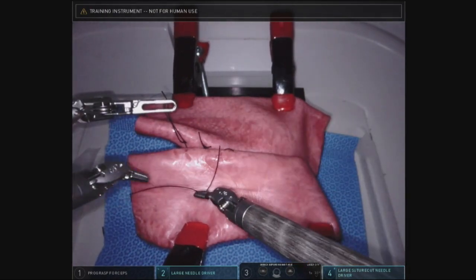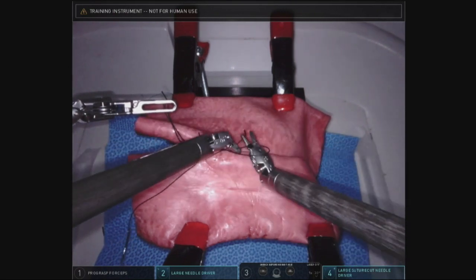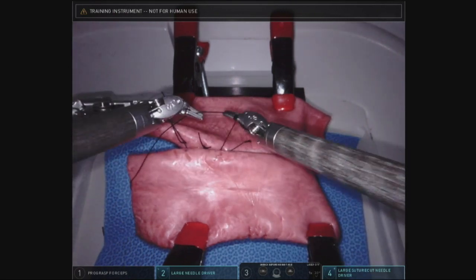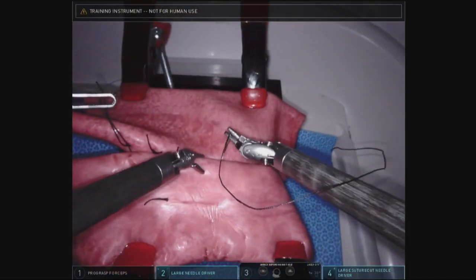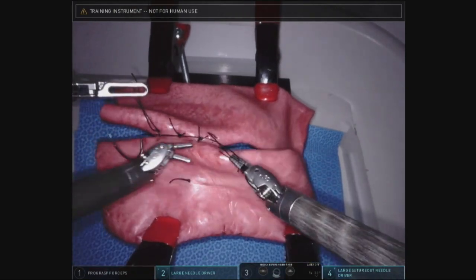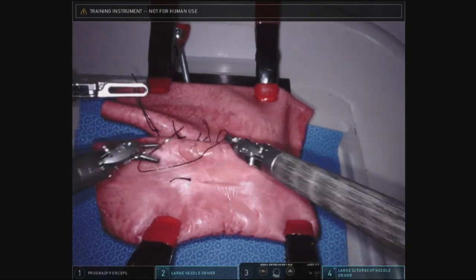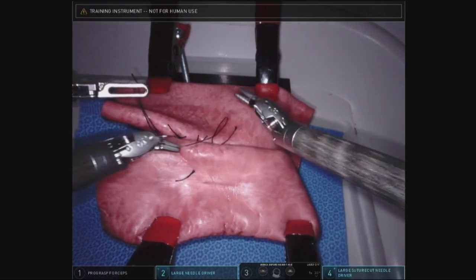The distance between each stitch should probably be about 2 to 3 millimeters apart. The loops of bowel you'll be given will be about 4 inches each, so your anastomosis can be as wide as 2 inches. So I would line up at least a 2-inch row of posterior silks here.